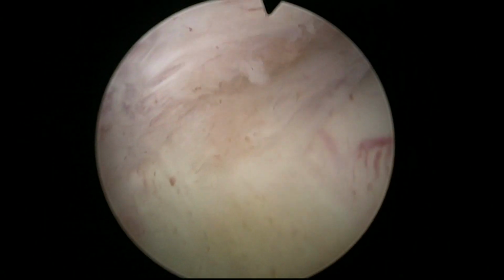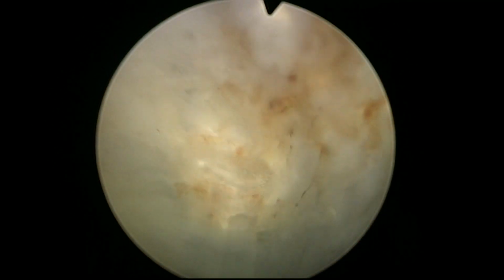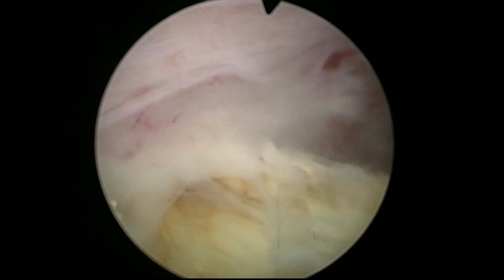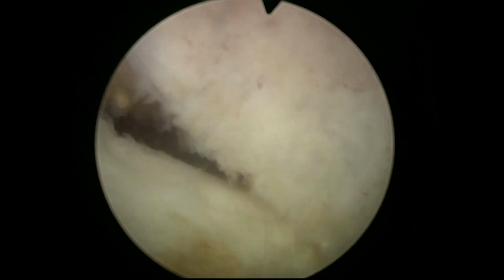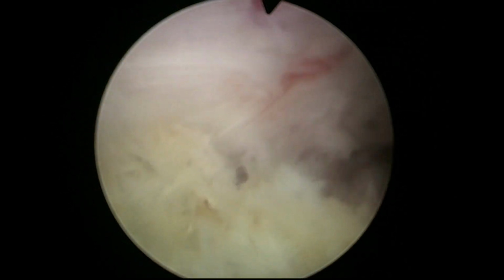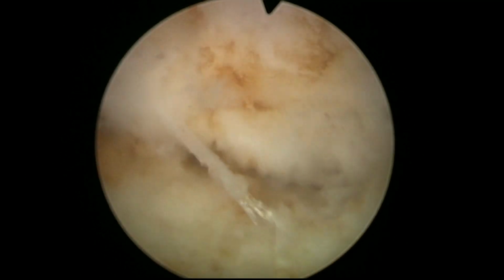You see here, tilting the adenoma in the bladder is not very difficult. And here, if you wanted to resect, you would stop here and then do the resection. So you need to leave a pedicle, especially if you use monopolar current, because if you use monopolar, there must be a way for the current to exit, and it will only cut if you leave a pedicle or if the adenoma is in contact with the tissue. But as I said, I felt a little bit adventurous, and I decided to try to morcellate this time. If you do the resection, you'll have to extract the chips, and it brings back some memories of the TURP era. I haven't done a TURP since, I think, 2003.